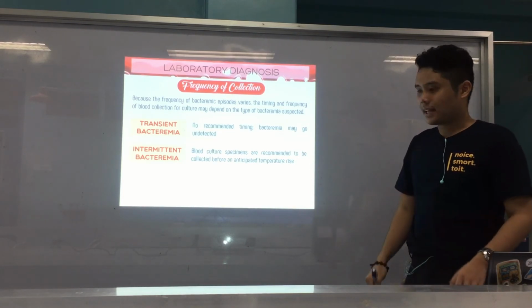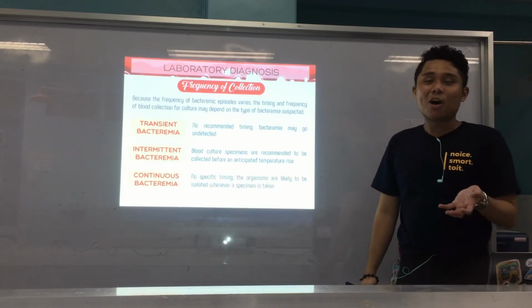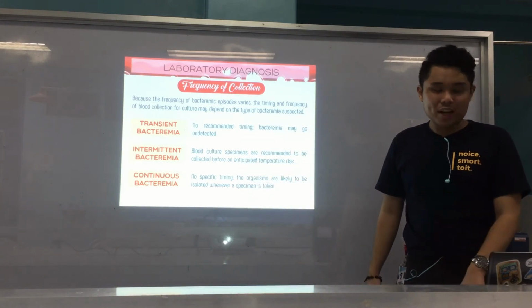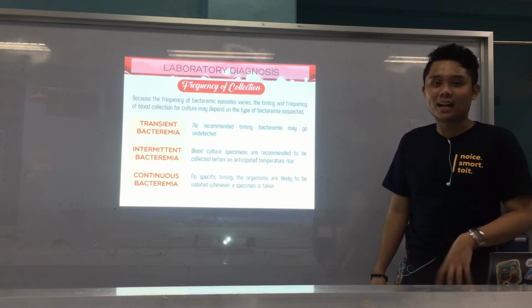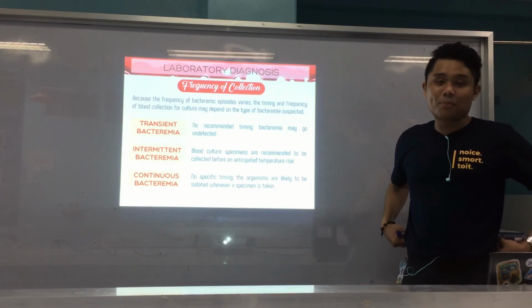Okay? All right. And of course, kung continuous, by the name itself, palagi nang ang kagaw kay gapuyo na gyud sa blood stream sa imong patient, naa na gyud siya sige there, then of course, you can collect anytime. All right. No specific timing. Anytime ra kay continuous man. Ang kagaw mismo nagpuyo na sa iyang blood, ganahan na siya didto. So anytime ma-collect ra nimo and anytime ma-detect ra pod ang kagaw.